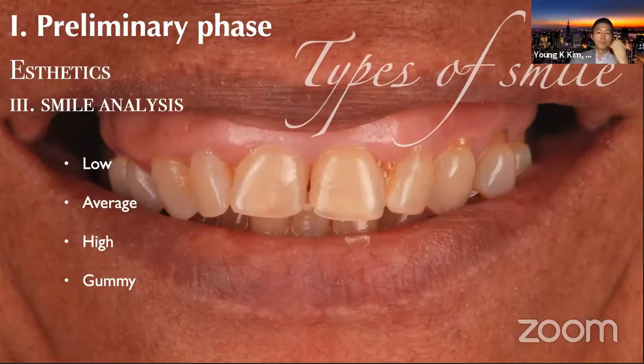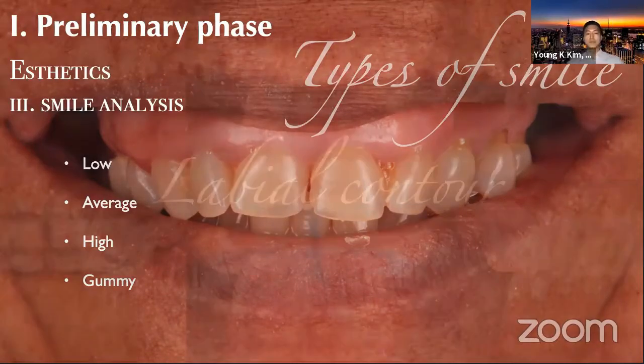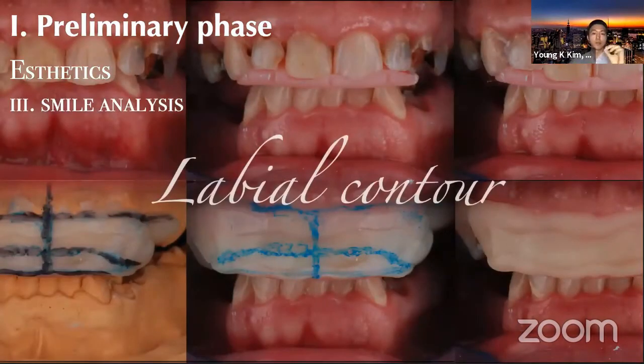So for me, if we are increasing vertical dimension, a lot of times we create a Lucia jig, or we can use a light-cured triad in the anterior to increase the vertical. And you go over all those vertical dimension assessments that I previously discussed.